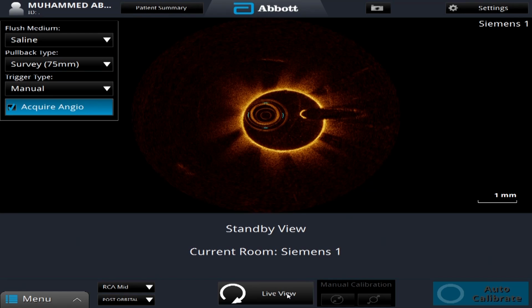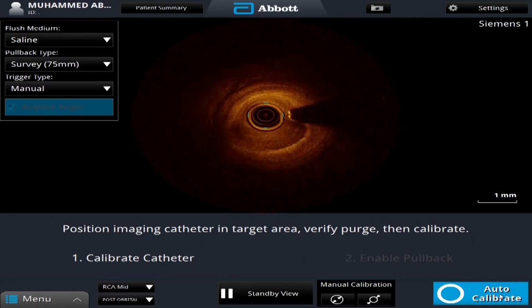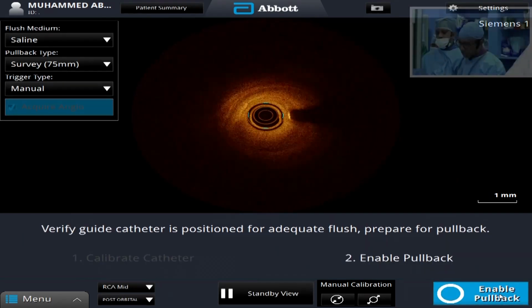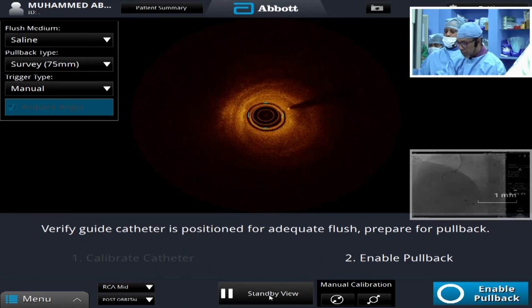Okay, we are ready. Yes, live view. Enlarge the OCT. We haven't given nitro, right? One second, hold on. We'll give some nitro also.